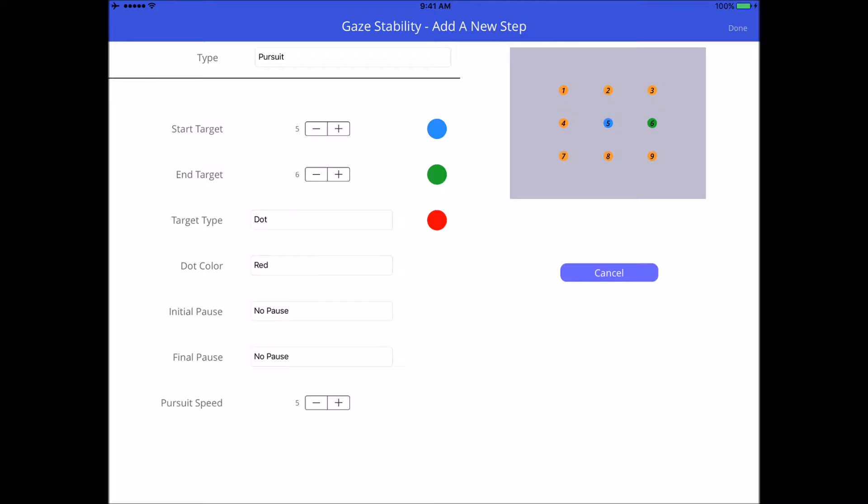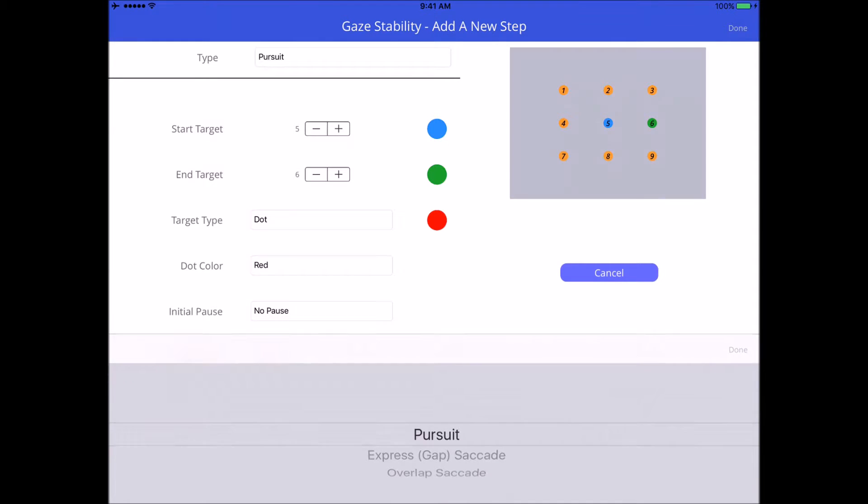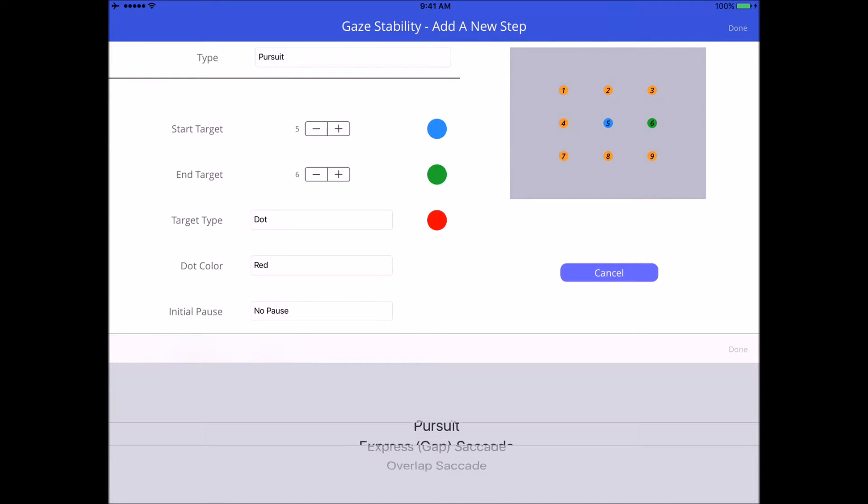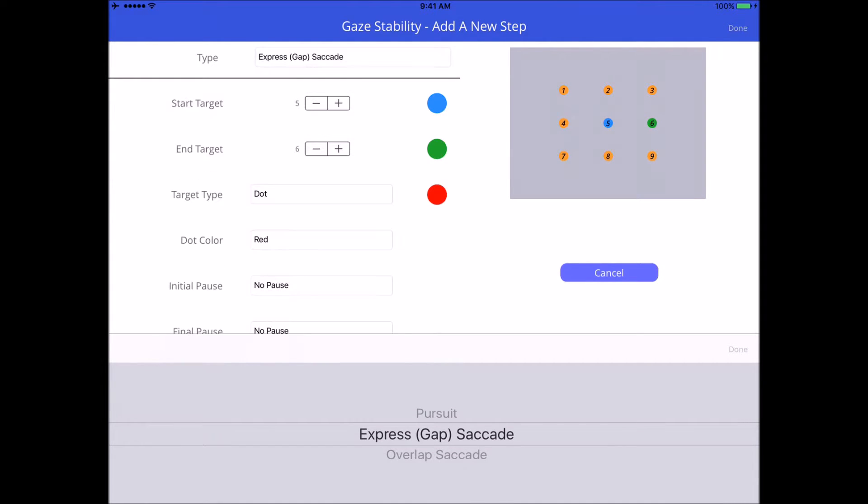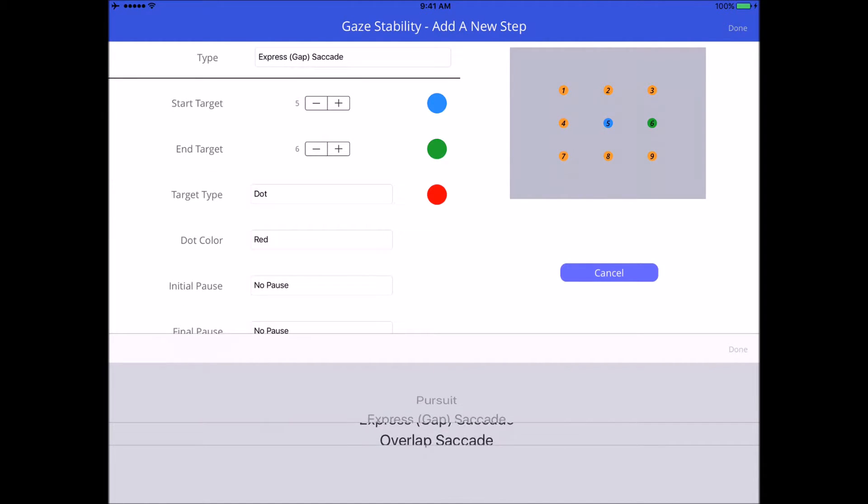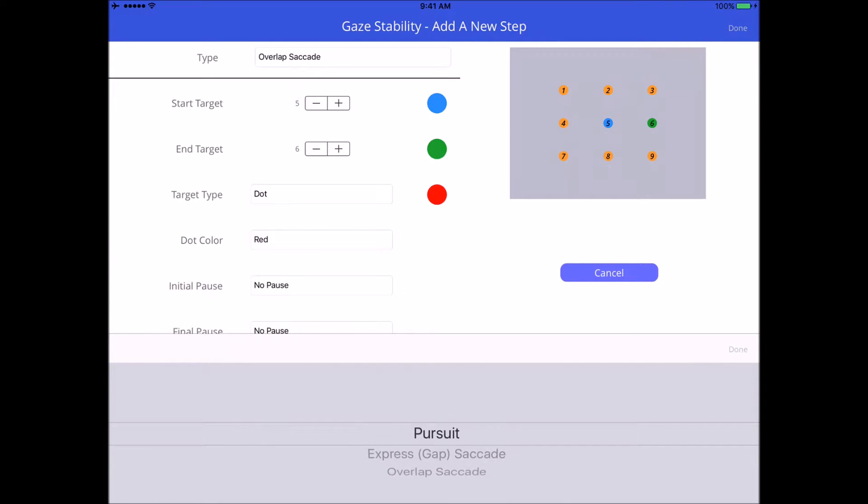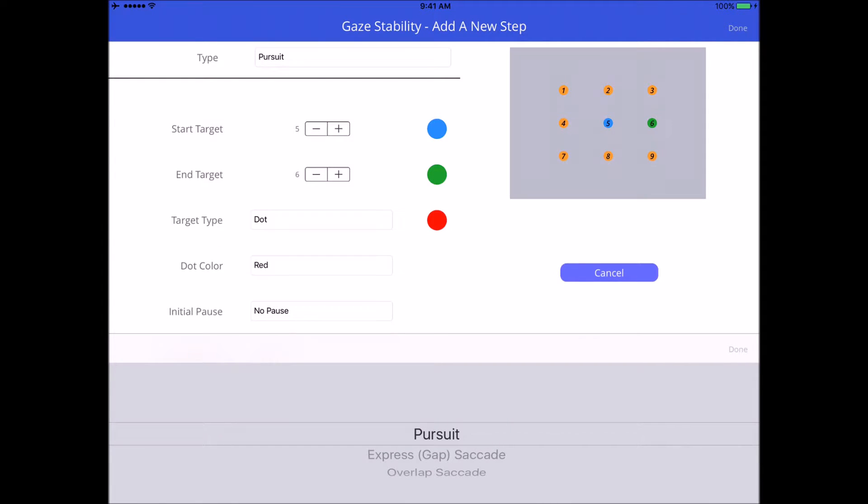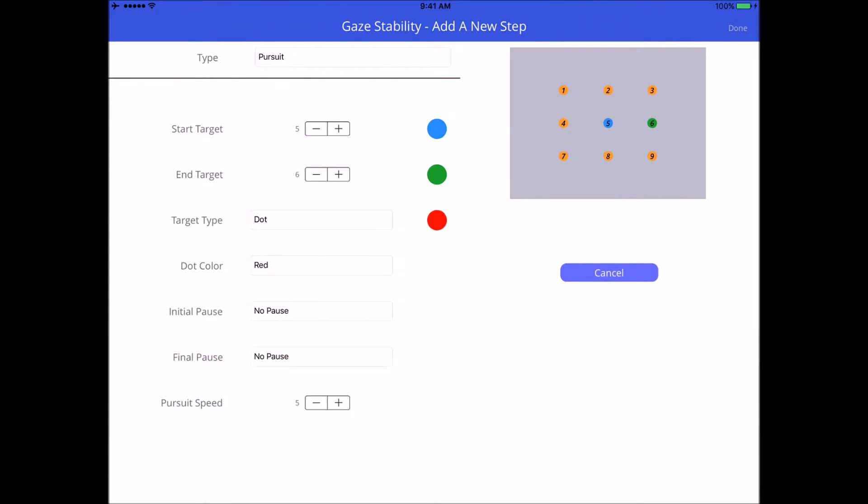I can select the type of motion that I want. If I want it to be a pursuit I'll pick pursuit, or it could be express saccade, overlap saccade. Let's just go with pursuit in this case, so we'll do the next one as a saccade so that way you can see the difference.